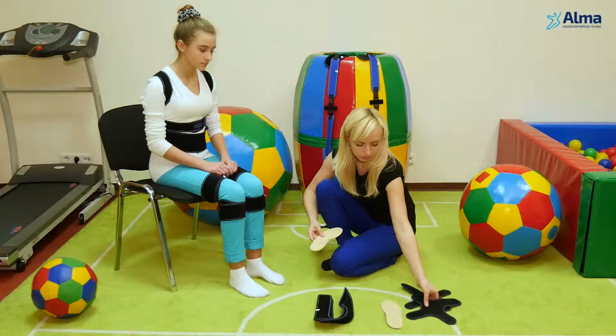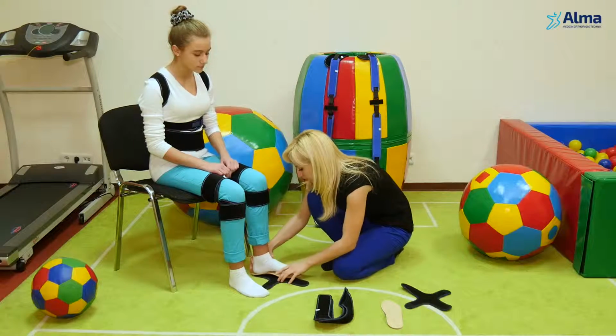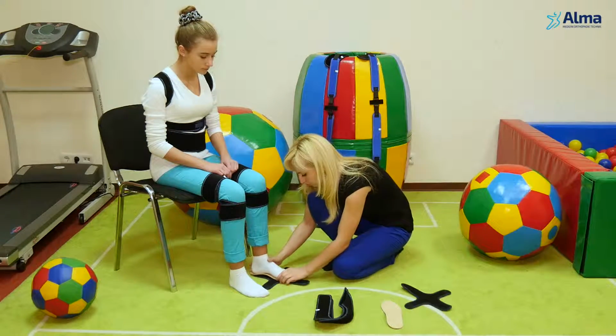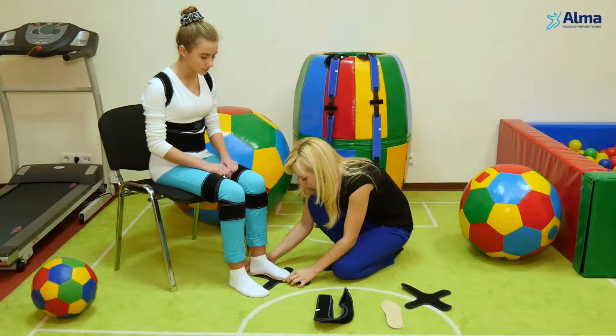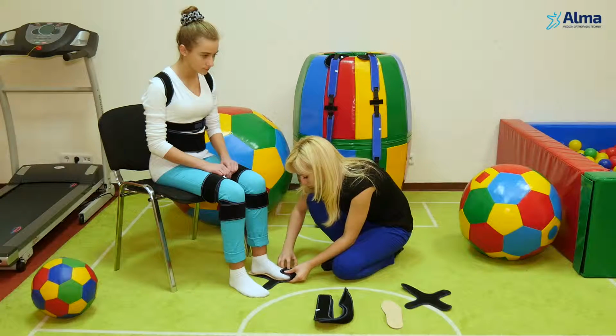Then assemble toe and sole element. Insert a supinator in it. If the patient uses foot control, the toe and sole element shall be preferably replaced with his or her foot control. Fastener of the fixed element shall be closed outwards.